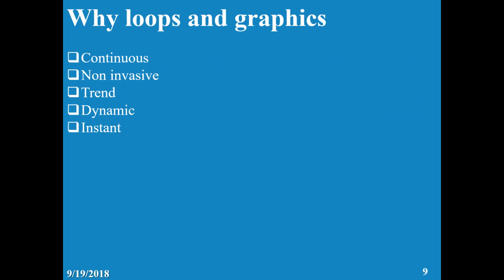The loops and graphics are both continuous, non-invasive, show the trend, show the dynamics, and they are instant. There is no delay between what you see and real life.